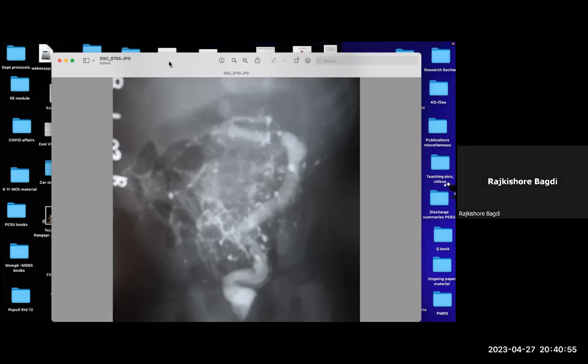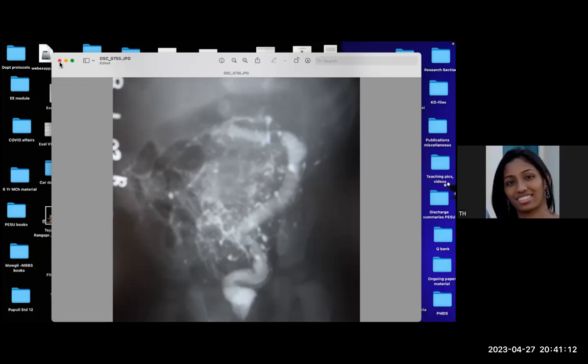Okay. So you must ask whether any pilot film was done before the barium enema was done. You have to be very careful as residents. You should not do barium enema without a pilot film. Was there already a perforation, and then you do it? Now, whether the perforation has happened because of the technique of doing the barium enema, or was it already there? Yes. How else does the pilot film help?